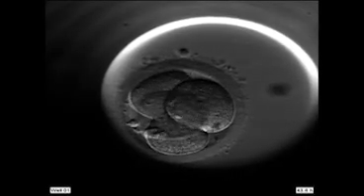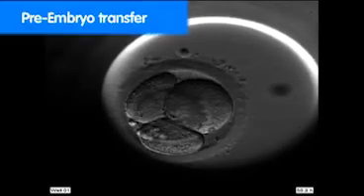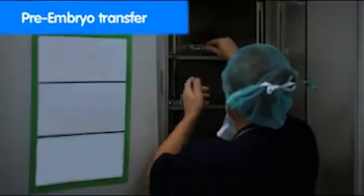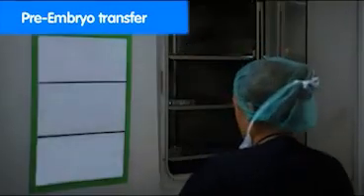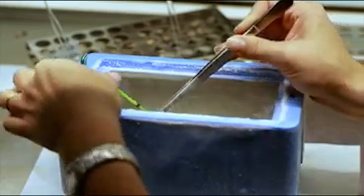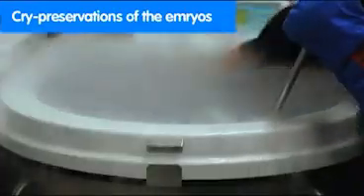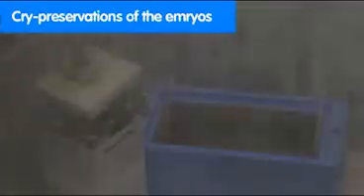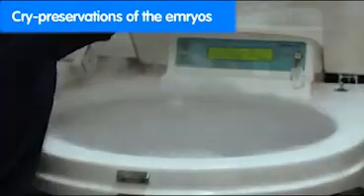Finally, embryo transfer is carried out. The best embryos are introduced into the maternal uterus. This procedure is carried out in the operating theatre, although in this case there is no need for sedation as it is a quick and painless process. Any remaining good quality embryos are frozen so that they will be available to patients when required.